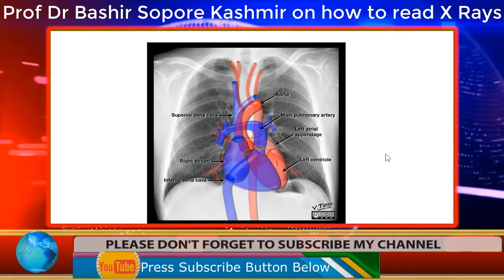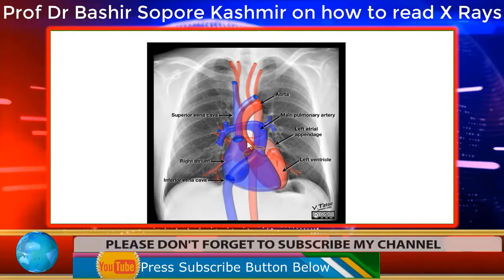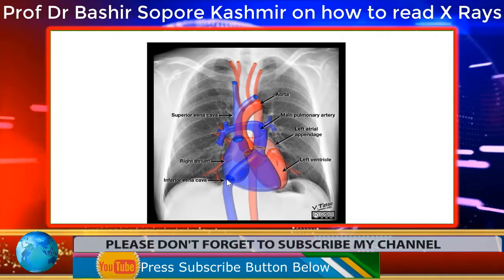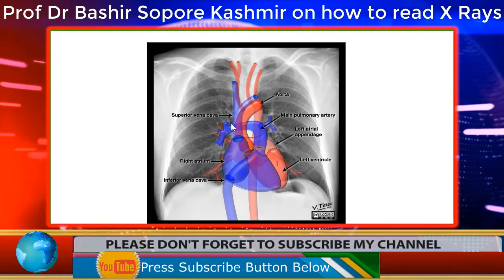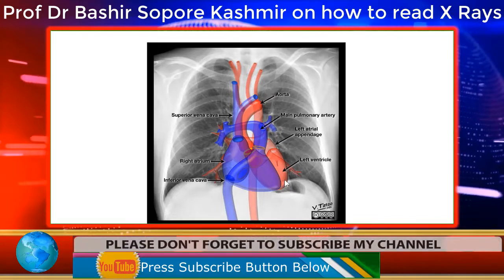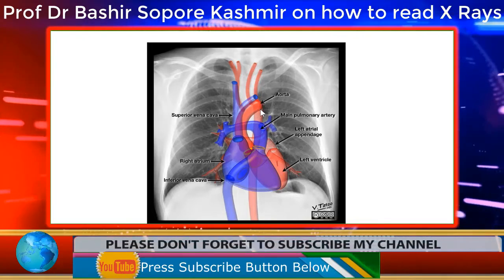Now if you see on the x-ray, the position of the heart, then we see it is in the middle between the two lungs resting on the diaphragm. And the right border of the heart is formed by the right atrium, inferior vena cava and superior vena cava. And left border of the heart is formed by the left ventricle as well as main pulmonary artery and aortic knuckle.